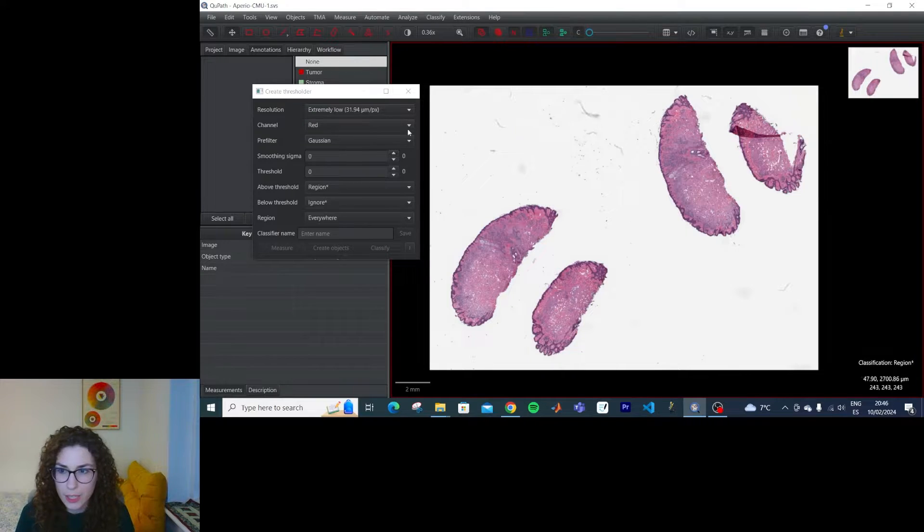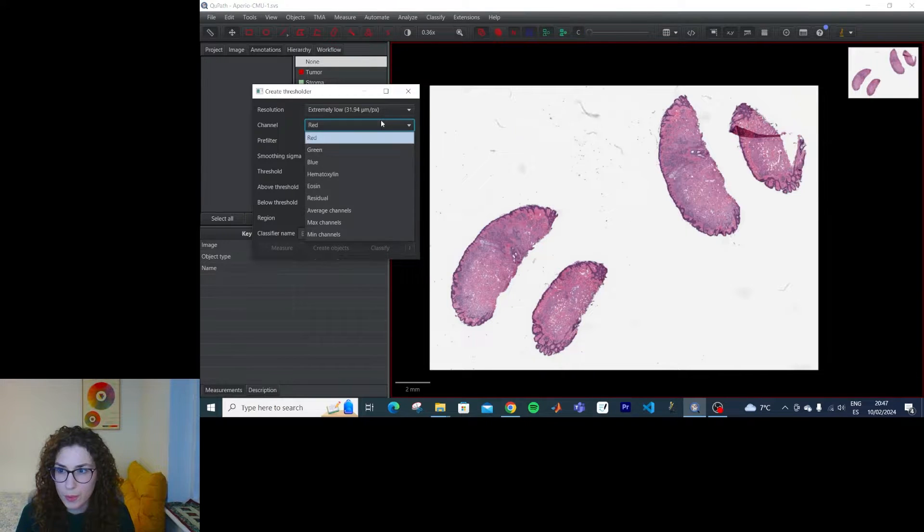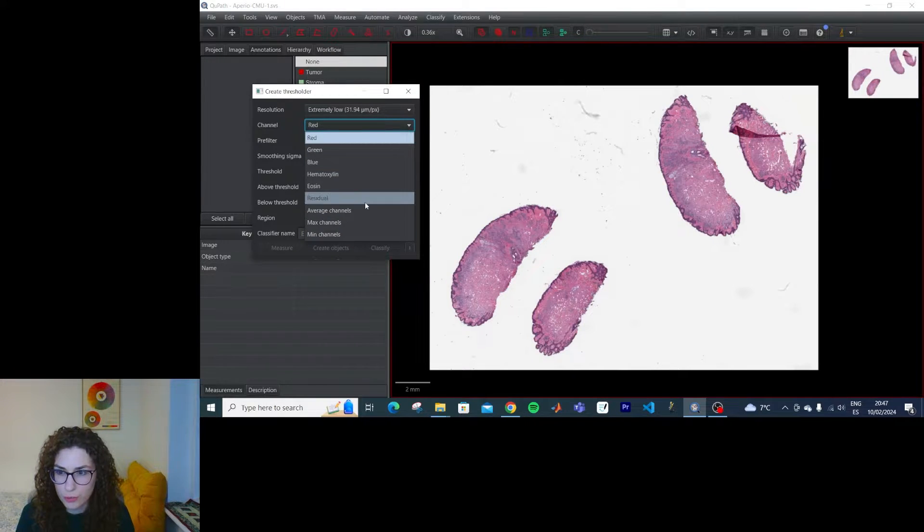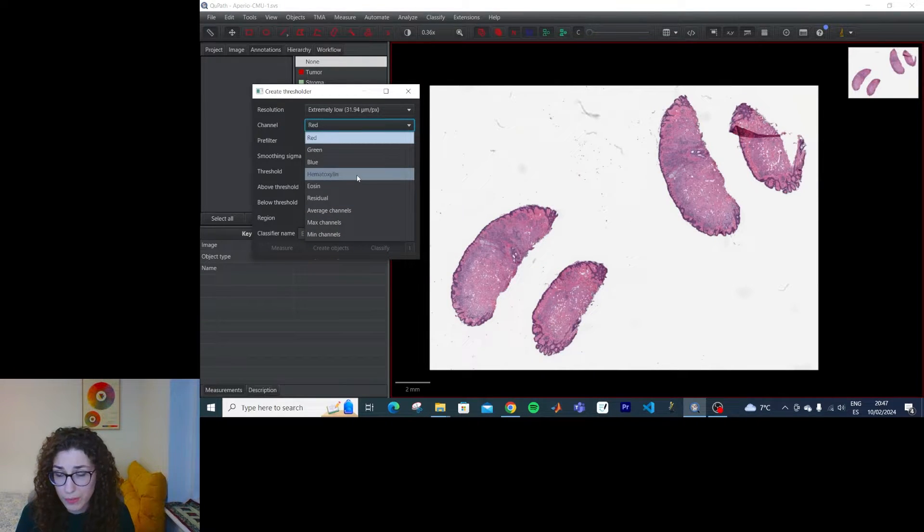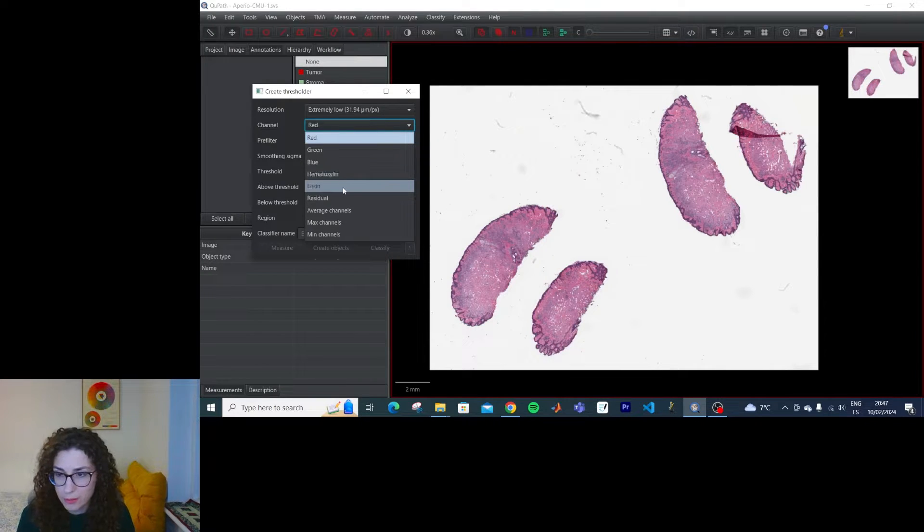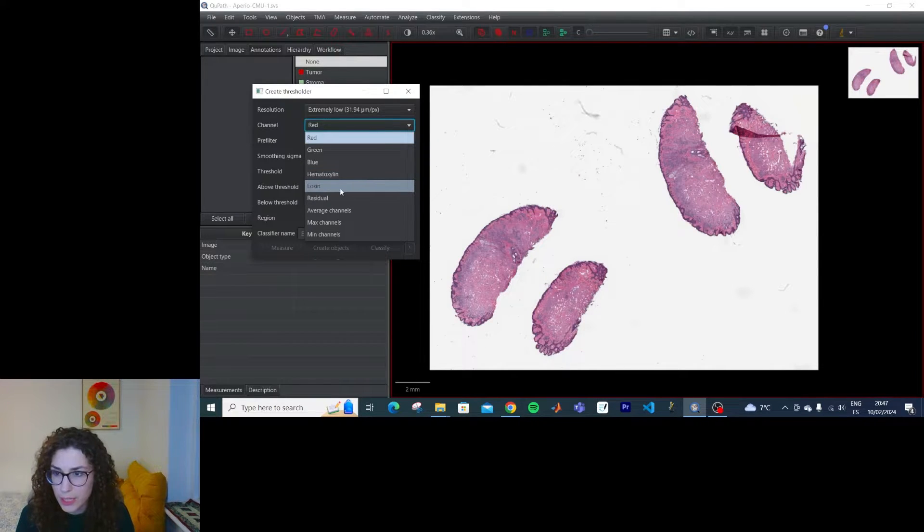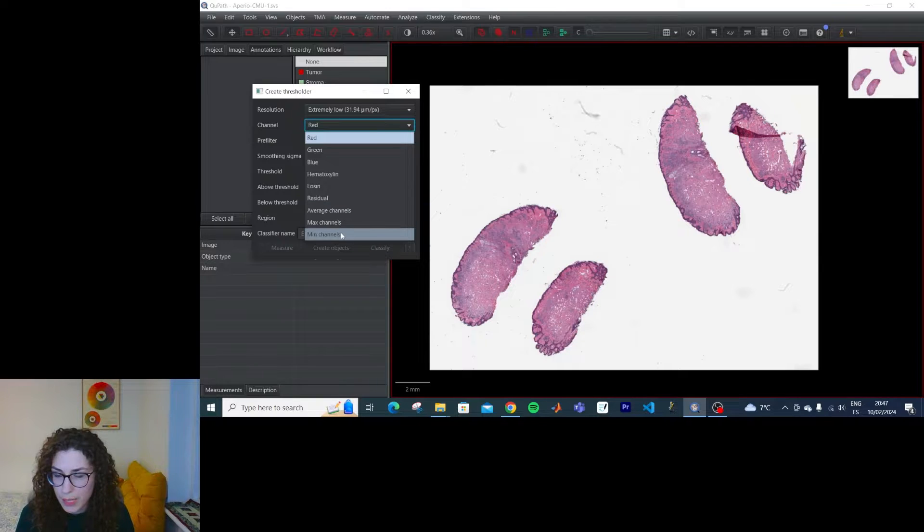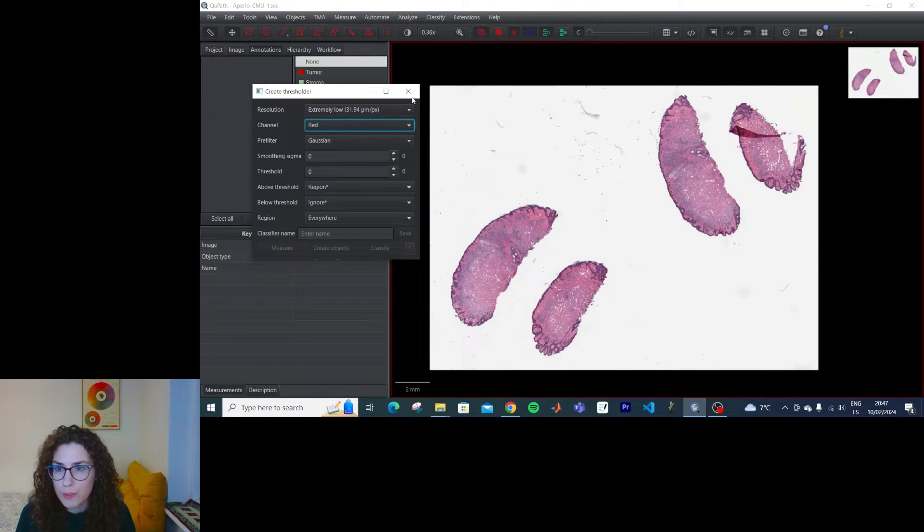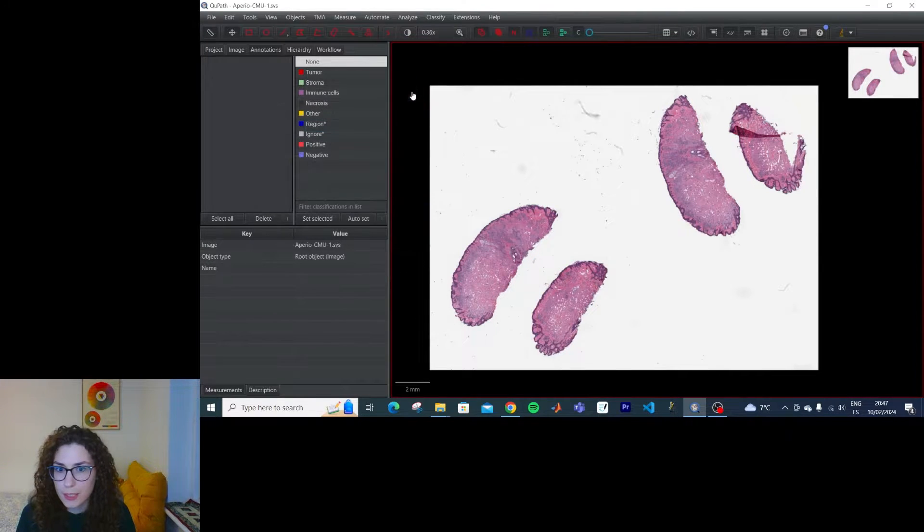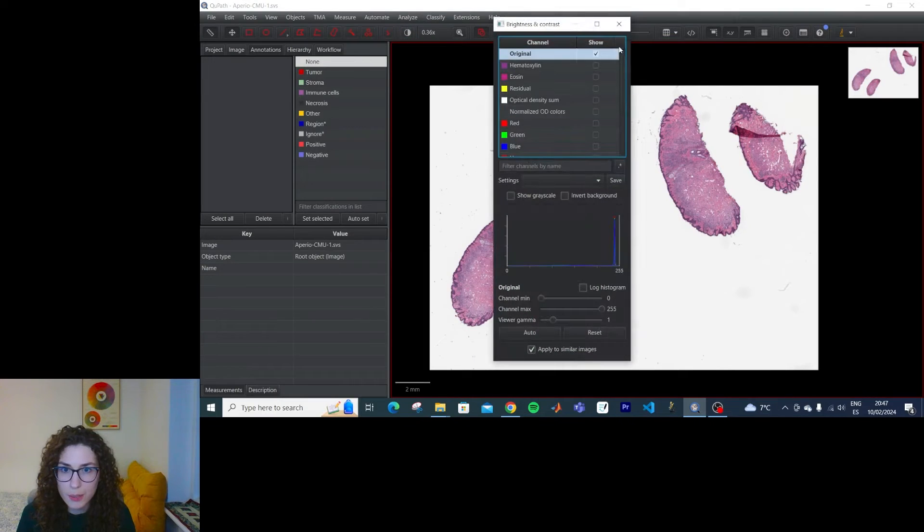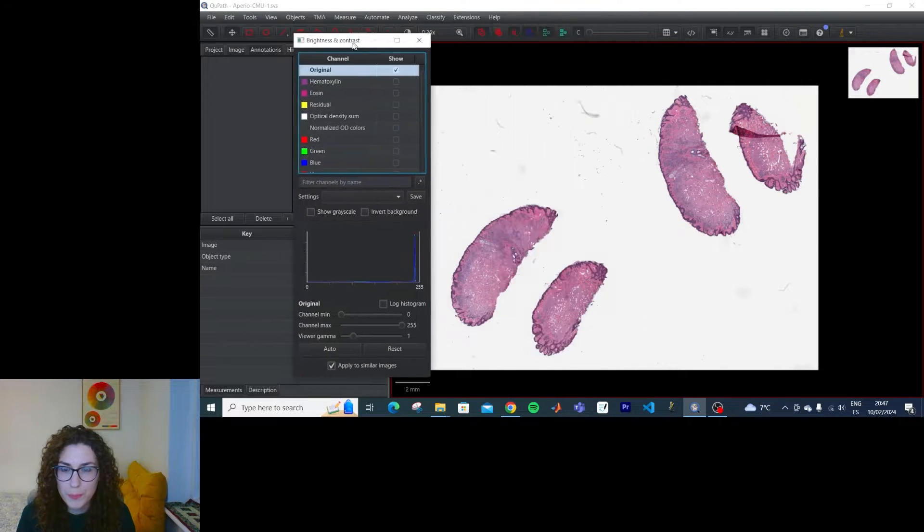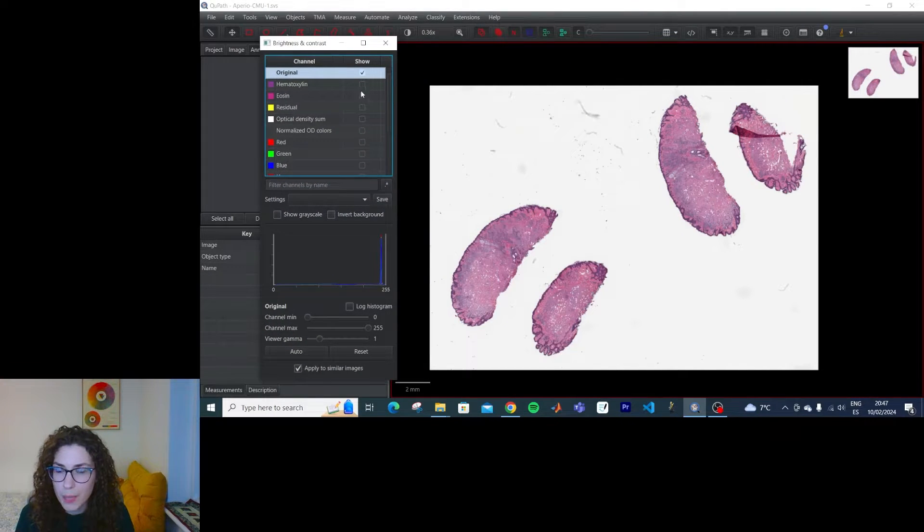So this is an H&E. We have these channels to choose from. We have the automatically deconvoluted channels, the red, green, and blue, the average, the max, and the min. You know what, first I'm going to check these channels and see which one may be more helpful.